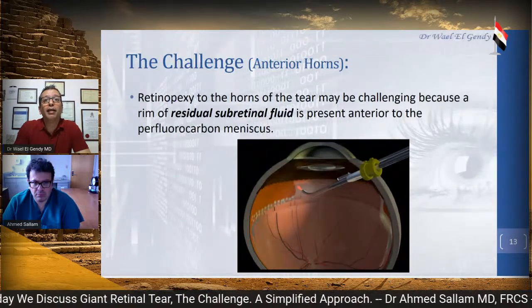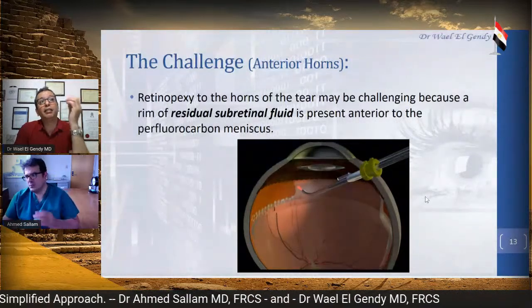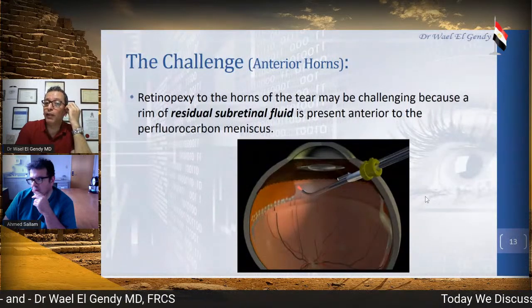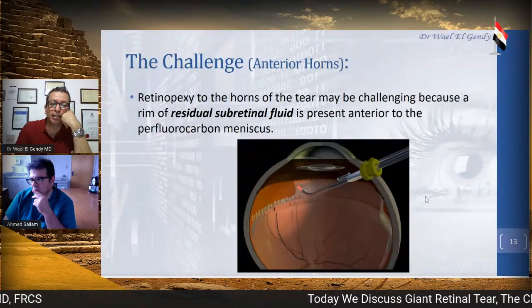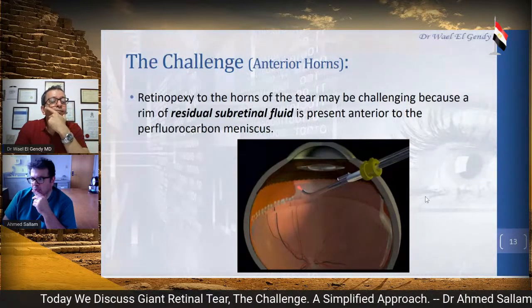Okay, so lasering the horns. We have difficulties with lasering the horns. What do you think, Dr. Ahmed, what's your technique to overcome the difficulties with lasering the horns? Yeah, so that's a good point.